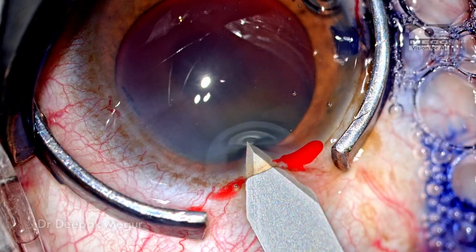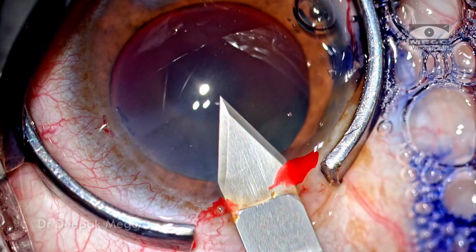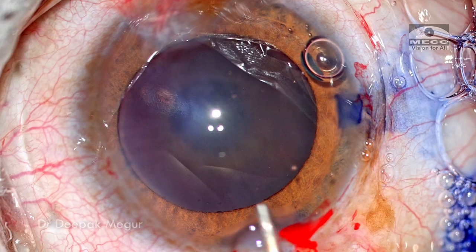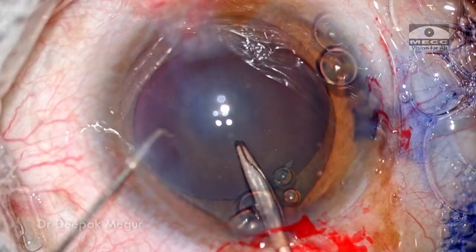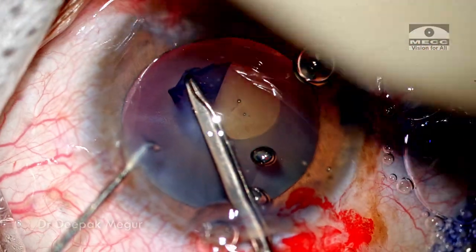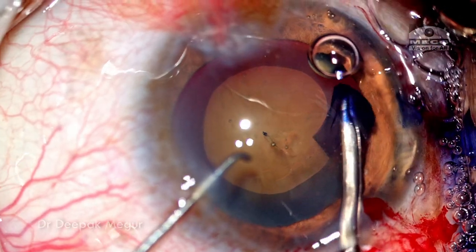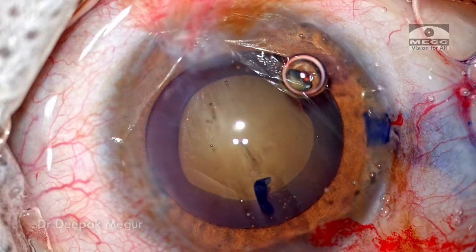Getting the rhexis right is extremely critical in these eyes because we have an extremely well-dilated pupil and also a large bag. So getting the right-sized and well-centered rhexis is extremely critical because that ensures better centration of the intraocular lens in the post-operative period. I'm going to use forceps to perform the rhexis. The flap is raised and as I'm tearing it I'm noting that the zonular health is quite good. The tearing is quite easy and now I have a rhexis which is about 5 millimeters in size and looks to be fairly well centered.